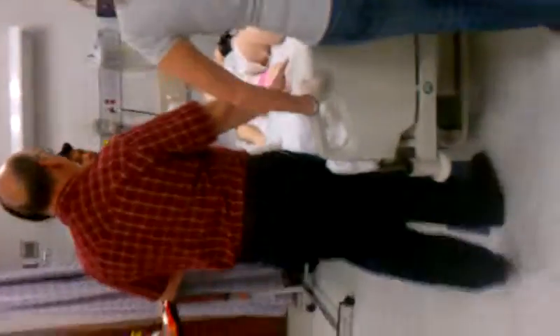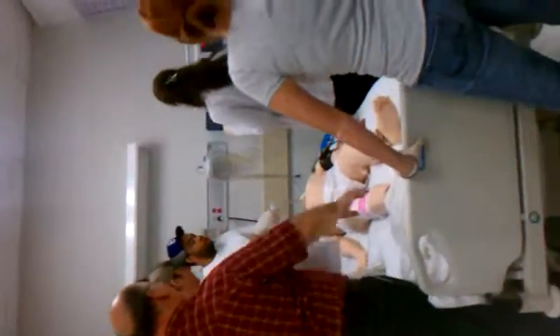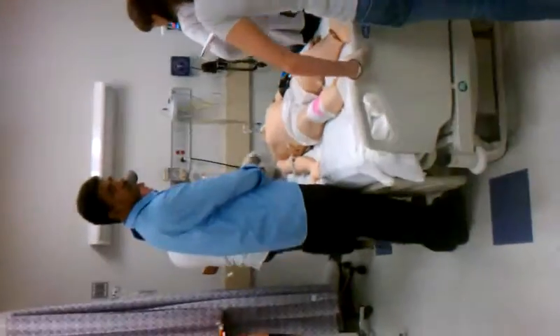Yeah, he doesn't ventilate well. I mean, on the ventilator. Go ahead and take him off. Yeah. Okay, so we got him on the ventilator. You trying to tell me? I might. Excuse me.